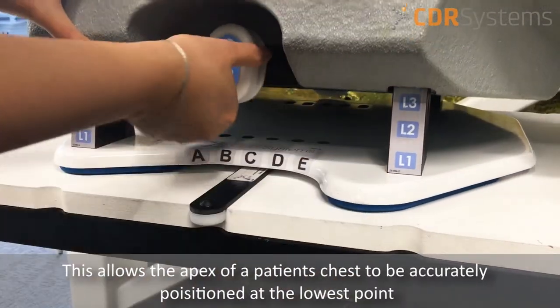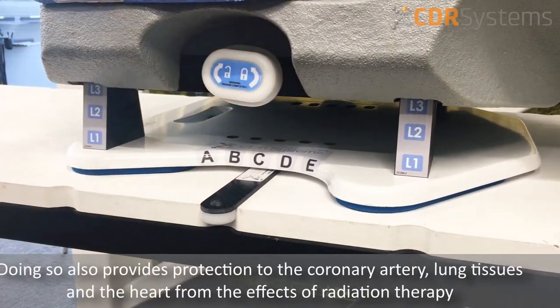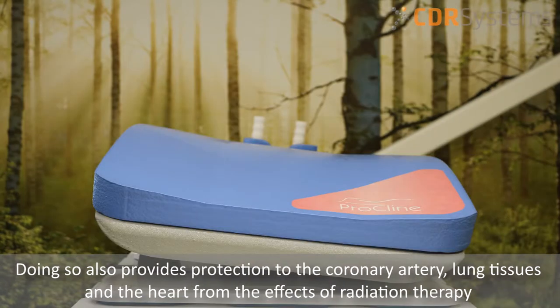This allows the apex of a patient's chest to be accurately positioned at the lowest point. Doing so also provides protection to the coronary artery, lung tissues, and the heart from the effects of radiation therapy.